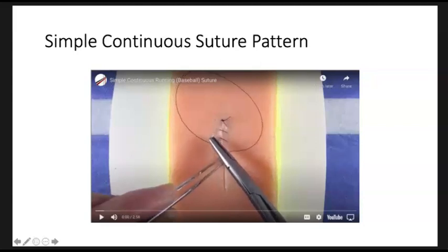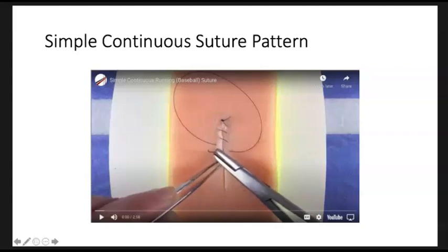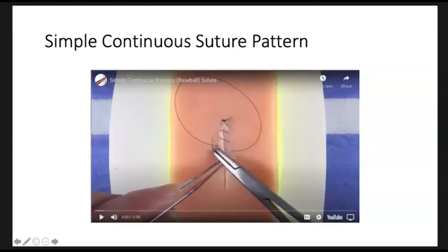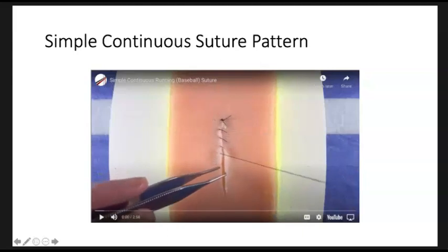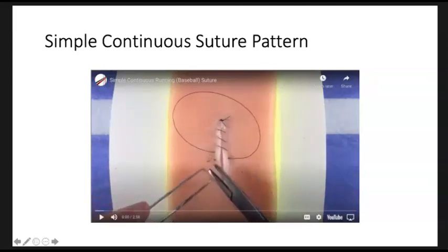Advance the needle through until 2/3 of it is through the skin. Then, with your needle driver in the pronated position, grab the needle directly at the skin level, ideally at an angle so as to optimally load it for the next bite. Rotate the needle driver in your hand and take the next bite. Continue to close the wound in this fashion.